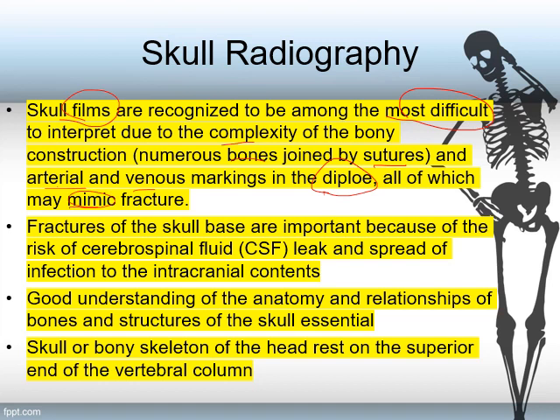So, ibig sabihin ng mimic, magmumukha siyang parang fracture. Pero actually, they are normal markings in the skull. So, sometimes pwede siyang ma-misinterpret or ma-misdiagnose ng mga doktor, especially if yung radiologist ay bago pa lang. So, sometimes it can be misinterpreted into a fracture where in fact it is actually a normal structure.